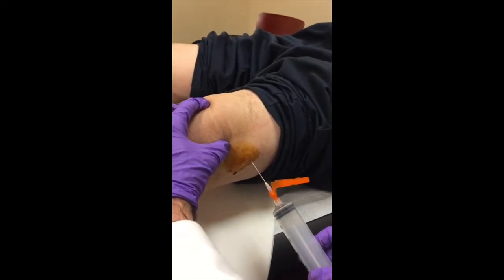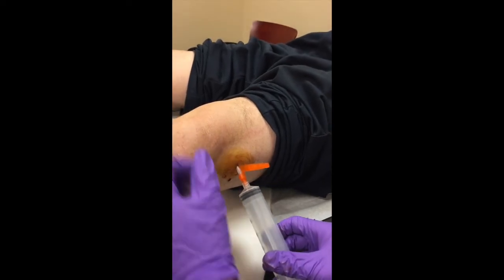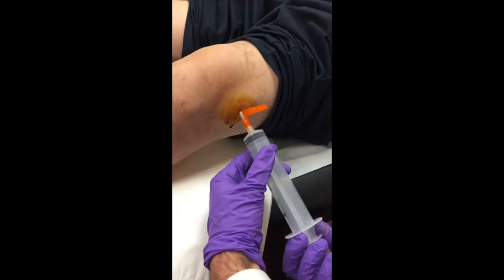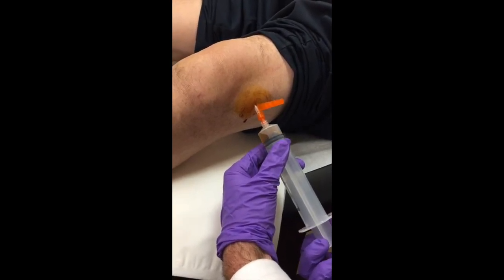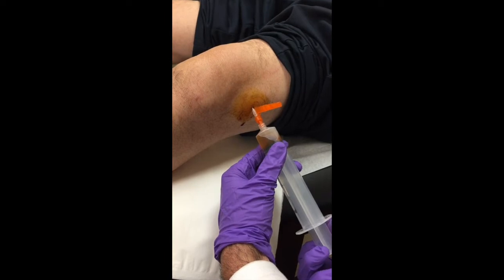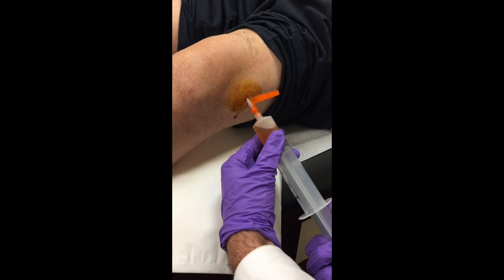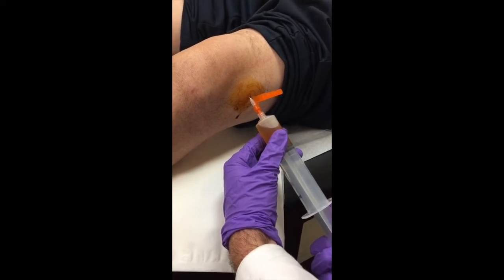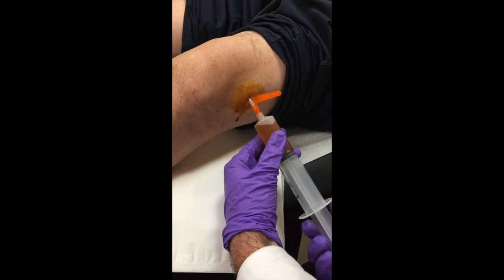Get your landmarks, feel a pinch on three — one, two, three. Once you're in, you'll feel a pinch and then a pop. Slowly withdraw the fluid — it's often going to be slightly blood-tinged from the local medication introduced into the capsule. Stabilize with one hand and pull with the other so you're not moving the needle around.